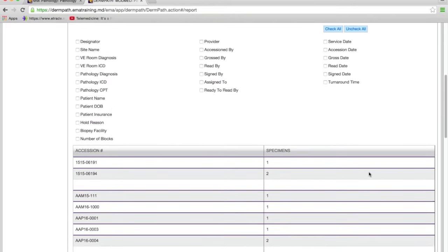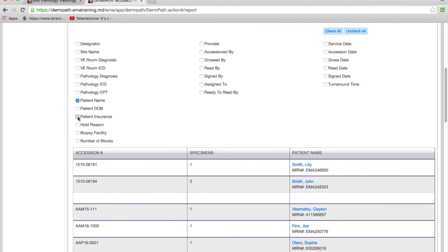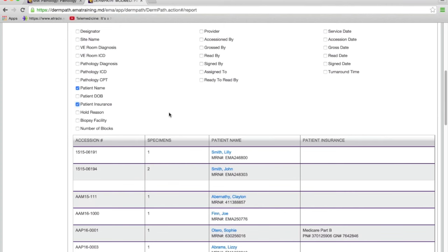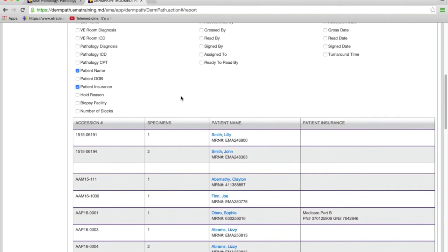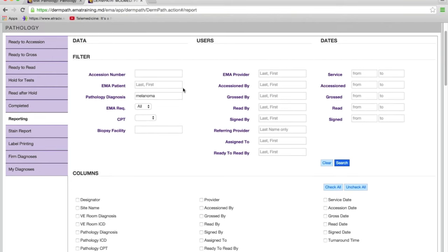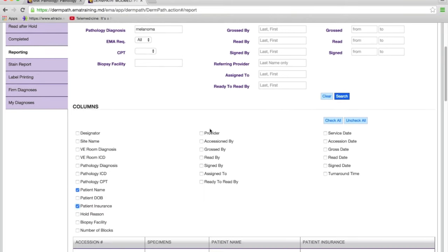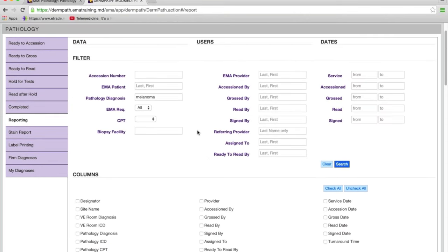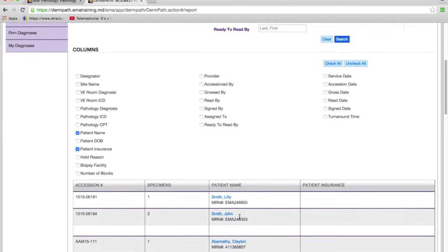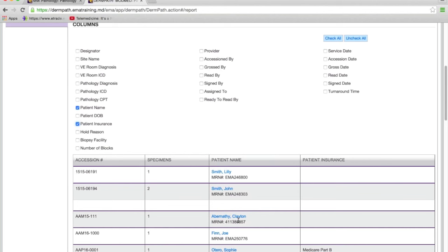Since I don't have many melanoma cases, I didn't filter by date. We get all the melanoma cases. Then you can add columns for patient name and patient insurance — because if it's Medicare, you have to report it. You have ways to use filters and then decide what data you want to see. You can also use the screen to locate a case by accession number. If someone calls asking where a patient's case is, you can search by patient or accession number and see exactly where it is in the module.